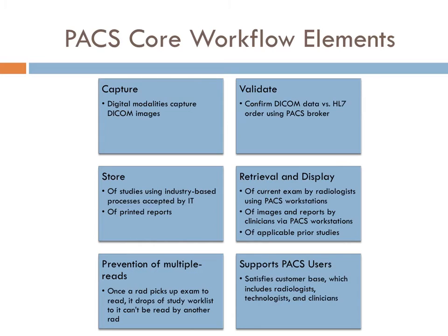Another core workflow element of PACS is that it prevents more than one radiologist from reading a particular study. I touched a little bit on that on the last slide. So once a radiologist starts the dictation, the instant notification is transmitted back to the core, triggering that exact case to be hidden from other radiologists to read it. So once radiologist A picks up the case to be read off of the work list, it allows for radiologist B and C to not be able to see it, so they cannot even pick the exam to read.